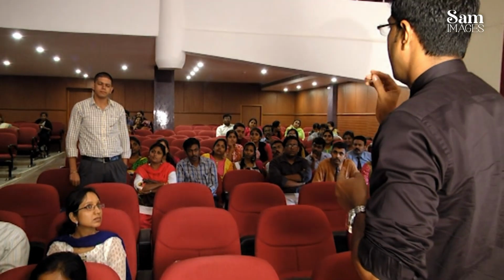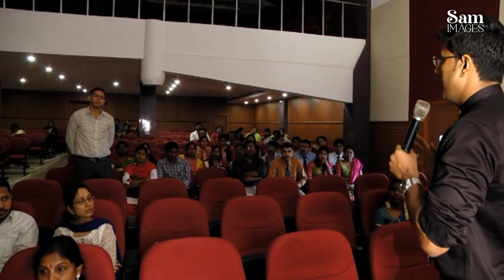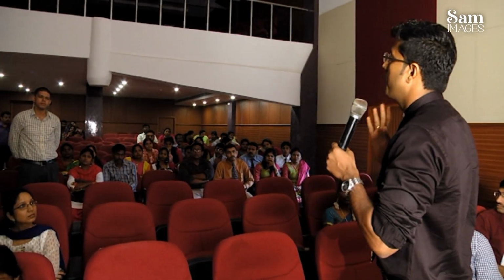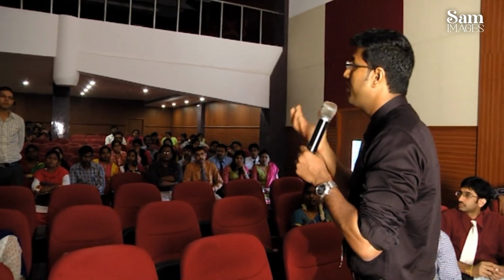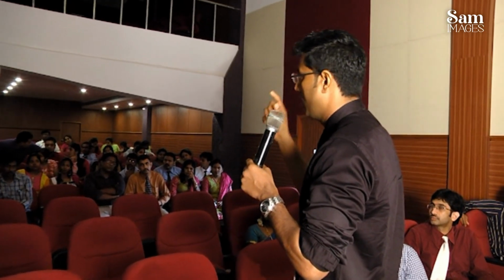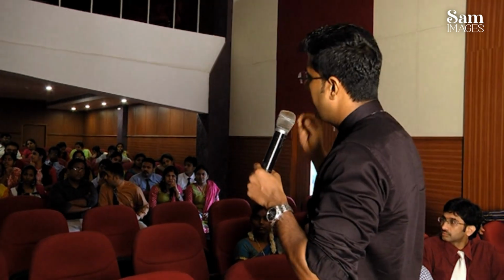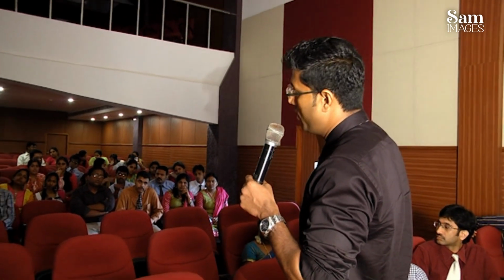the bone that is there in the periapical region is not a very hard cortical bone like that of the mandible. I told you even mandibular lesions can be seen provided they become big enough to expand the cortex. So in periapical lesions, because of their superficial location, they do expand and thin out the cortex to a certain extent where ultrasound is able to pass through.